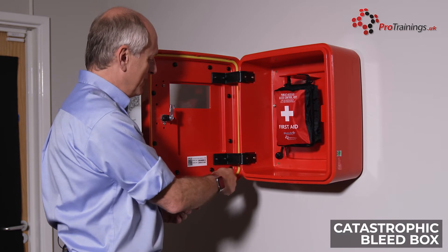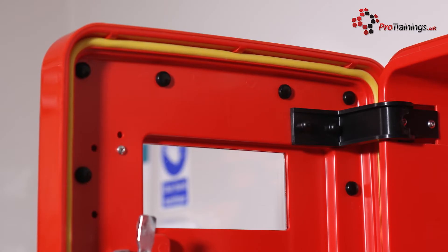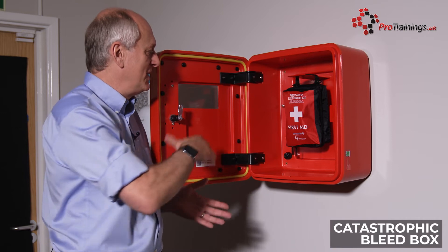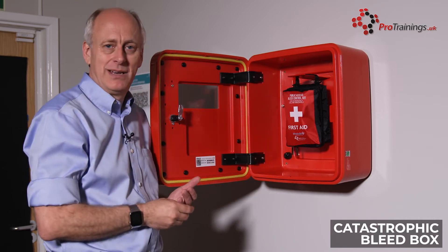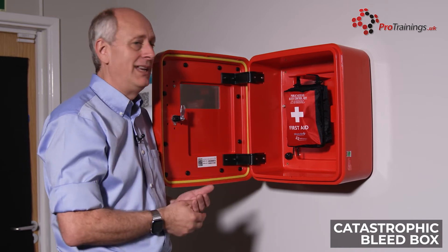Now with the kits themselves, around the outside here there is a yellow seal, and this seal provides a good watertight seal for the box. As you can see, there is plenty of room inside if you are going to have a larger kit, a multi-use kit, or any of the other kits on the market.